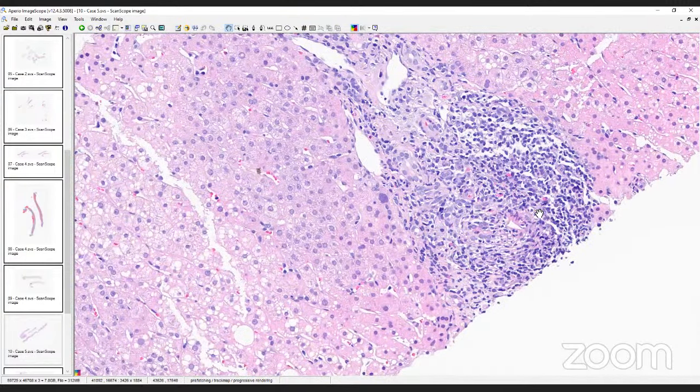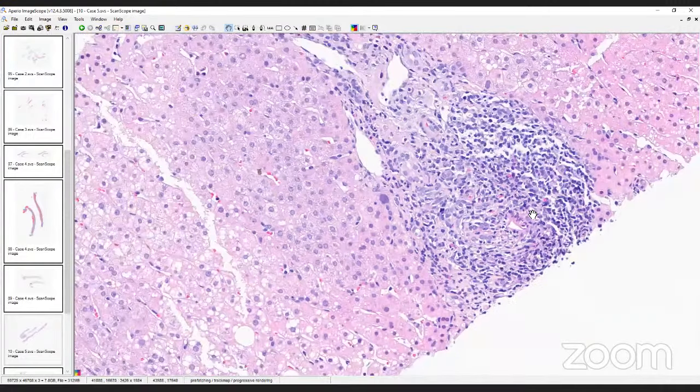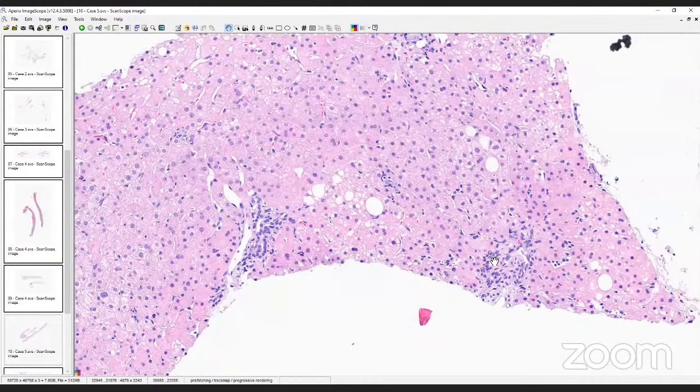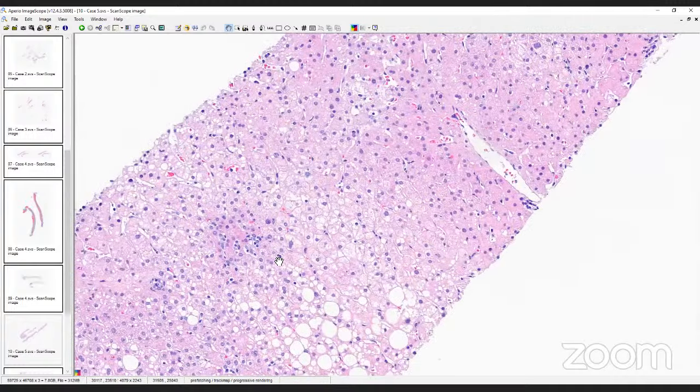So this is what I would call lymphocytic cholangitis, meaning, as the name explains, there is cholangitis and it's because of the lymphocytes. So in this portal tract, we have lymphocytic cholangitis, we have a few plasma cells, we have some eosinophils, there is no interface hepatitis, and it's the bile duct that's the target of attack. And then you keep moving and I see some steatosis. The theme is the same. We have small portal tracts, a little bit of this and a little bit of that, nothing very specific. There's a little bit of ductular reaction in this one, and we keep moving.